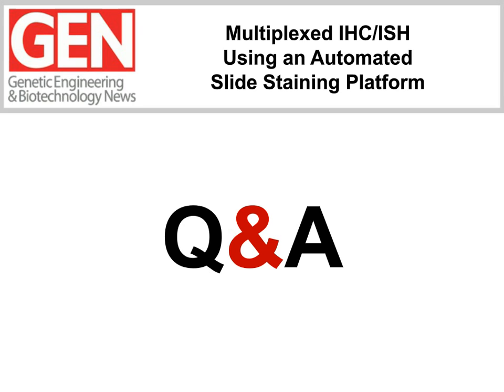That can range from anywhere from 6 hours to 8 hours, depending upon how many fluors are being used. If I'm using the maximum amount of fluors, it could be an 8-hour experiment.